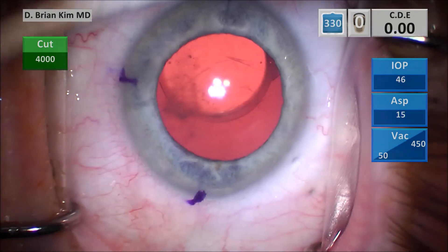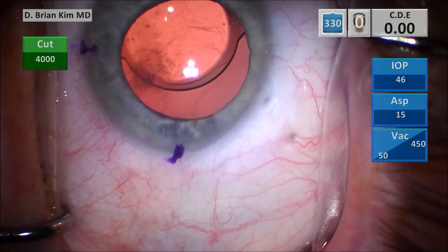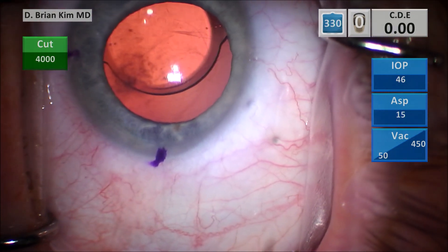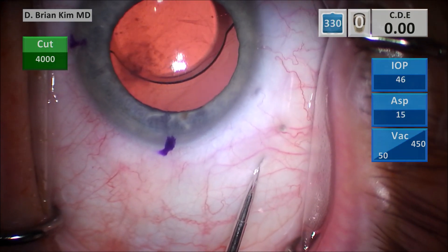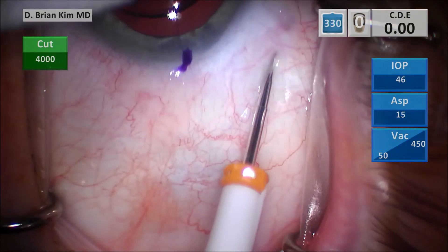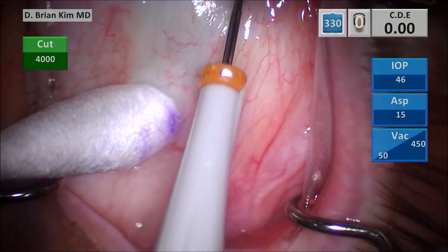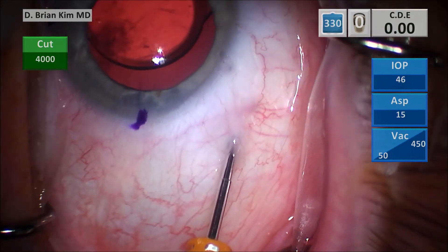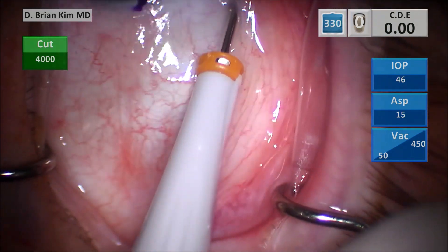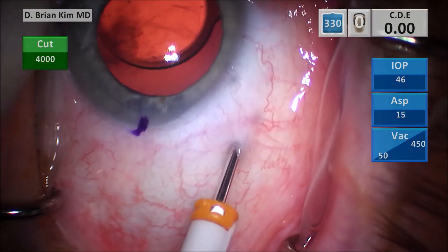I go ahead and make my mark for my sclerotomy, which is about four millimeters posterior to the limbus. This is my pars plana trocar placement. I'm going in tangentially with a needle — I puncture through, then I rotate, and then go straight down towards the nerve, and that's the placement of the trocar.